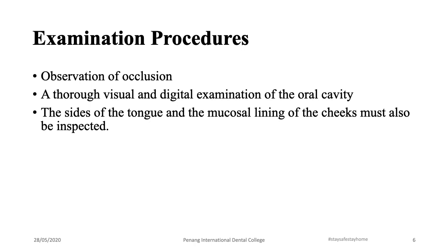Sometimes it can happen that your teeth arrangement might have gone wrong. You might think that, okay, when I did the trial, the teeth arrangement was absolutely fine. I could see that there was maximum intercuspation, but now the patient has a different bite.